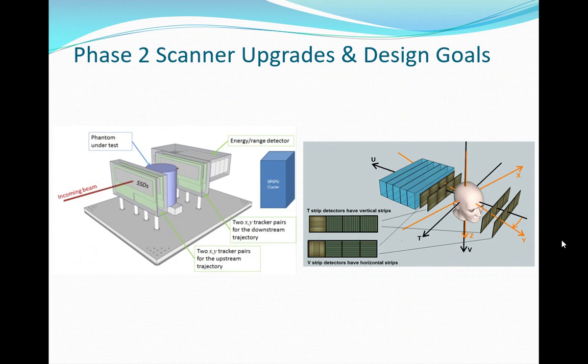So those actually, believe it or not, even though it's less sophisticated, it has a certain advantage to us. They're still not extremely wide. Typically, where the spread is happening is a few meters from where you're at. So to get a beam like this wide, for the imaging purposes, starting from a meter or 2 meters away is still a very tight angle range. But essentially with pencil beam, which pretty much everything built from now on is going to use, you can assume you know exactly the entry point.